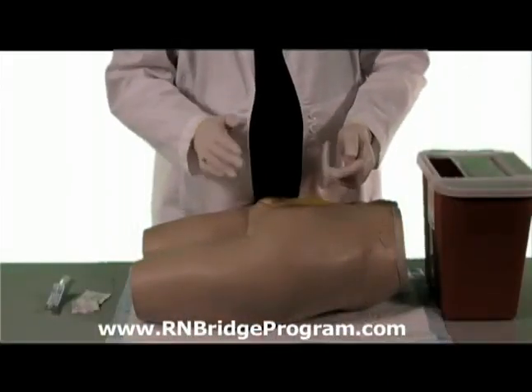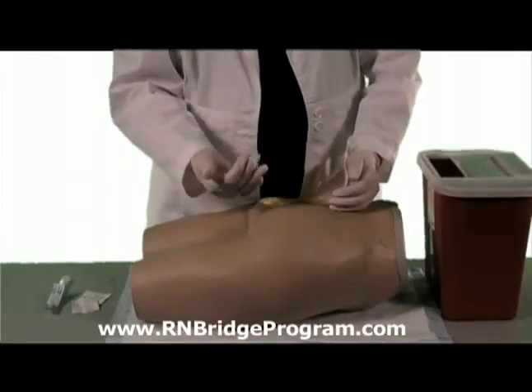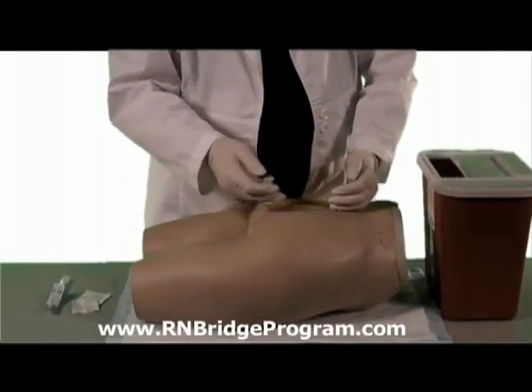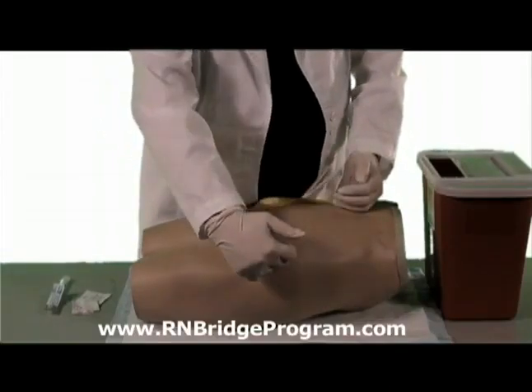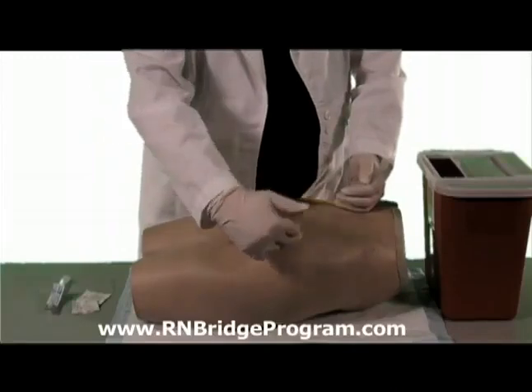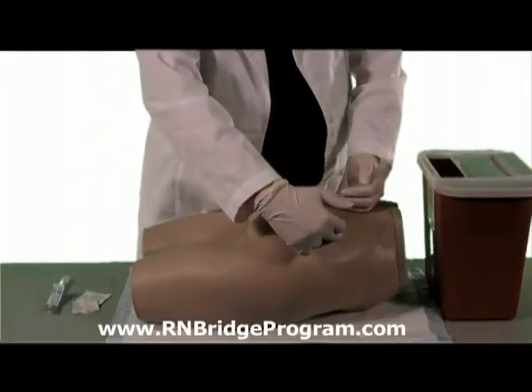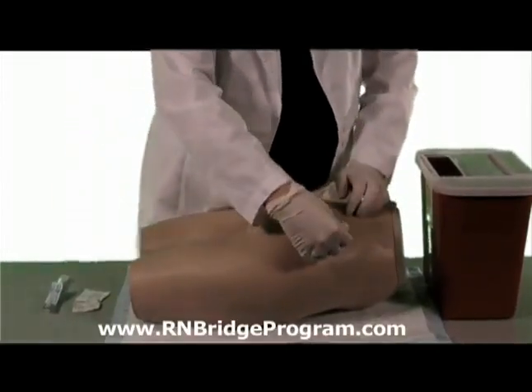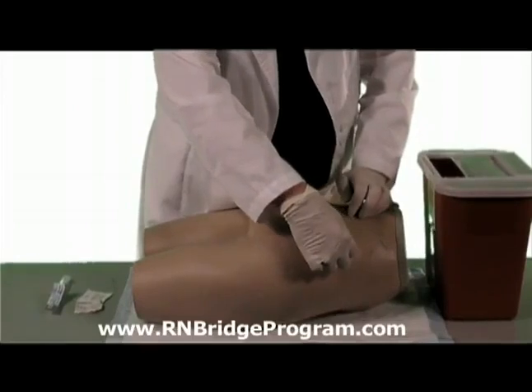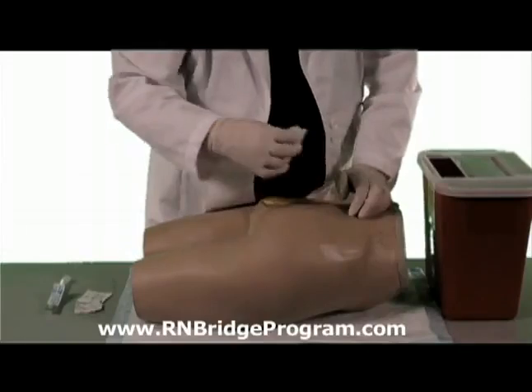Okay, so here we are back at the patient again. We're going to go into the gluteus maximus muscle. Draw your landmarks again, both vertically and horizontally, making a crisscross pattern on the muscle itself. And remember, we're going into the upper outer quadrant. Once you find your landmark, take your alcohol, put it on the site where your landmark is, and draw a circle from the inside out. We're going from clean to dirty.